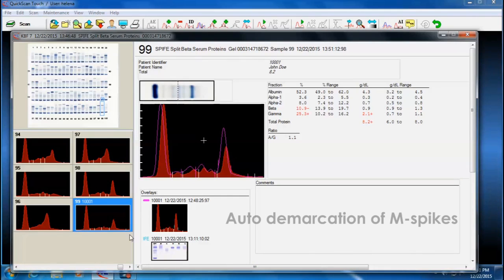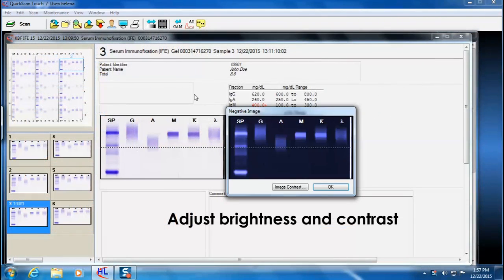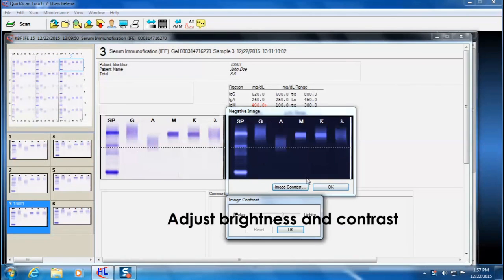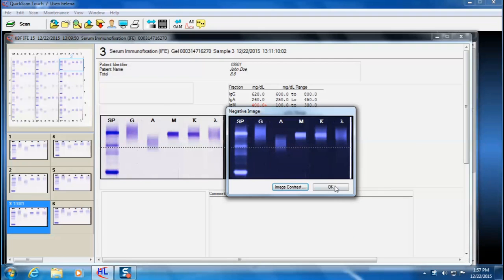To improve reproducibility from tech to tech, monoclonal M-proteins can be automatically demarcated. The option to adjust the brightness and contrast of pattern images, or even completely reverse pattern images, enhances visualization of immunofixed monoclonal proteins for easier interpretation.